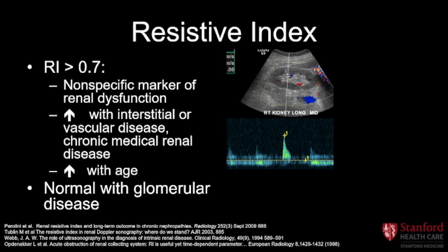Okay, so this is a patient whose resistive index is pretty high, but if you look at this carefully, who believes it's diastolic flow? Oh, nobody. You guys are so smart. Okay, so this is not real diastolic flow. This is intrinsic machine noise, which we call clock phase jitter. And it is symmetric above and below baseline.